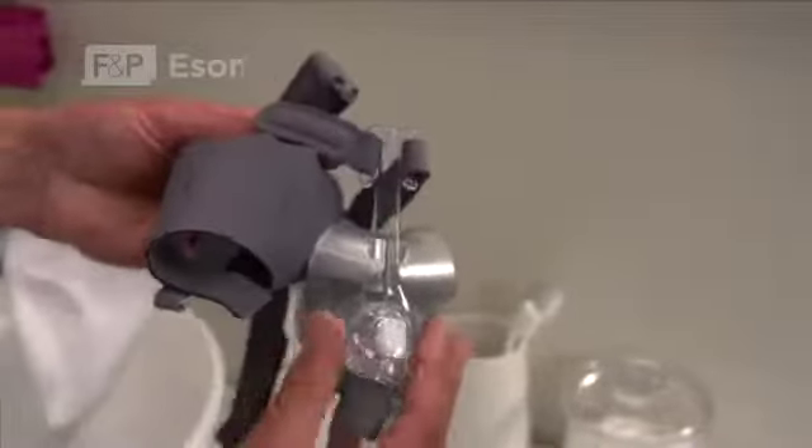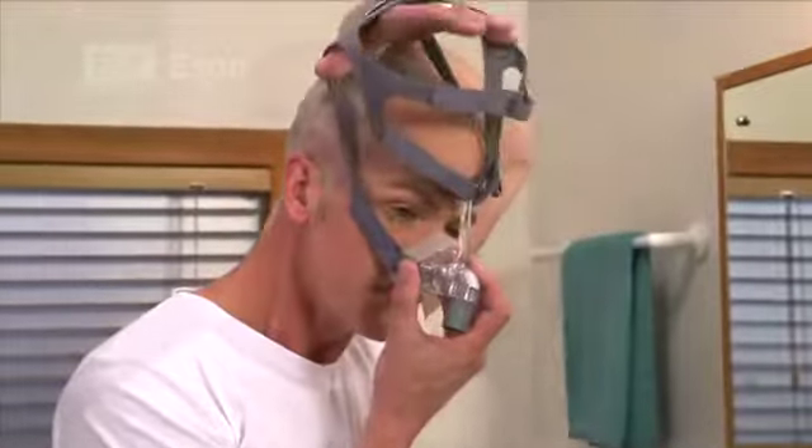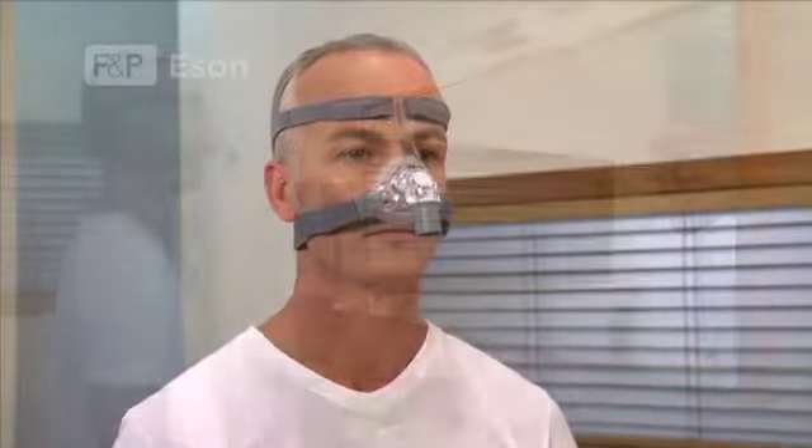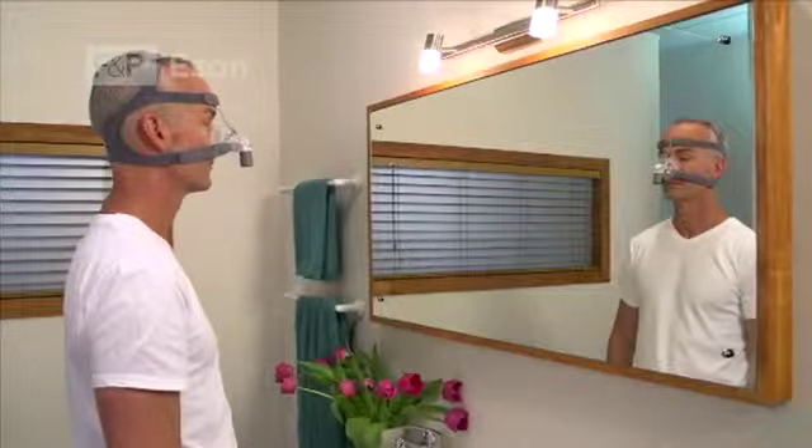Your mask comes assembled, ready to use. The F&P ESON comes with a range of advanced mask features which have been designed to deliver the comfort, seal and easy use that Fisher & Paykel Healthcare masks are known for.